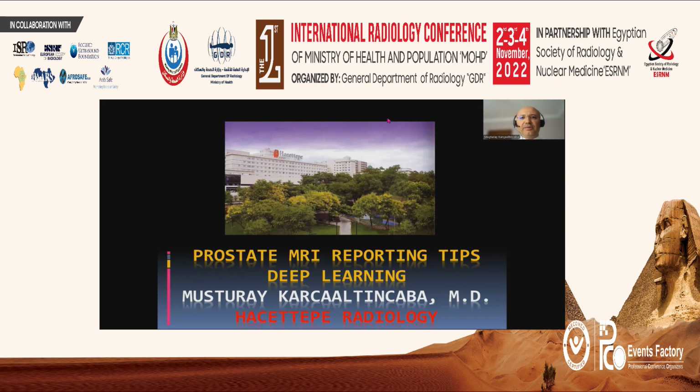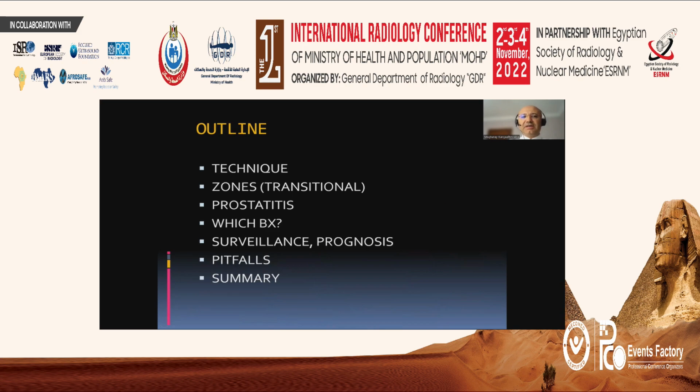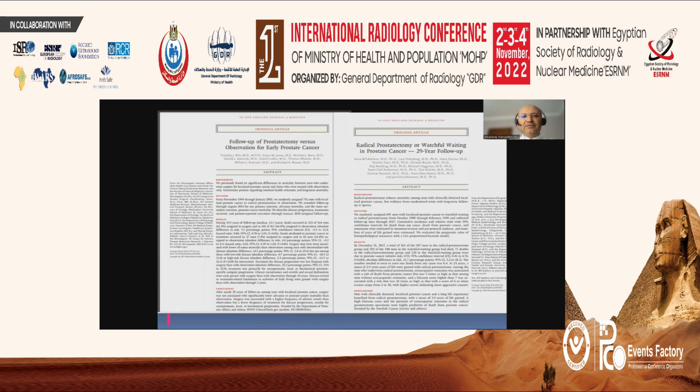Karçaaltıncaba from Hacettepe University. I'll be talking on prostate MRI reporting tips and deep learning algorithms. So we're going to talk about the technique and the zones and the prostatitis and which biopsy methods should be used, and we're going to go over the pitfalls.